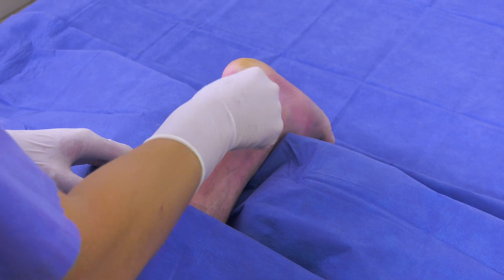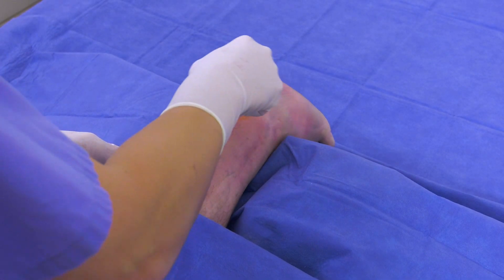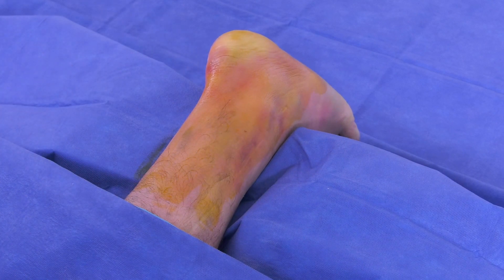The whole procedure takes about 15 minutes and can be done in the outpatient setting. Prior to the procedure the patient is prepped and draped in a sterile fashion. I place the patient face down on the exam table in order to more easily access the Achilles tendon.